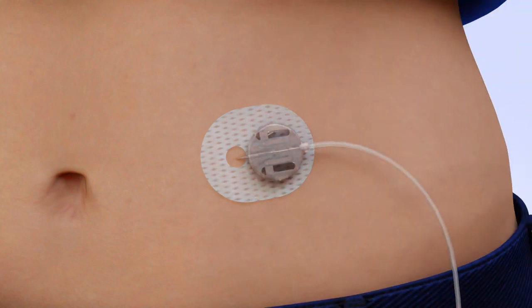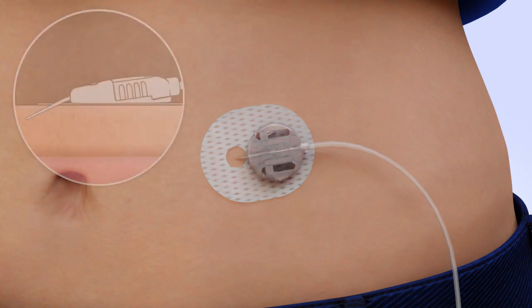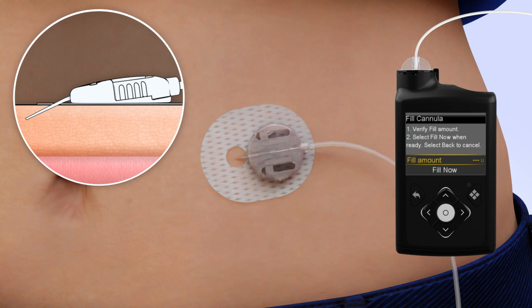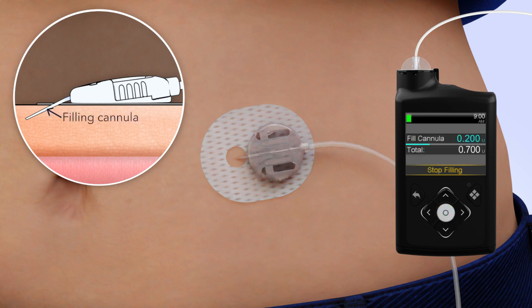Now that the introducer needle is removed, the cannula is empty and will need to be filled with insulin. On your pump, select Fill. The Fill Cannula screen will appear with either dashes or the amount you previously used. The cannula requires 0.7 units of insulin to fill. To change the fill amount, press Select and use the arrows to scroll to the amount needed and press Select again. If the amount is correct, press Down to Fill Now. Press Select. The home screen will display the insulin as it fills the cannula.